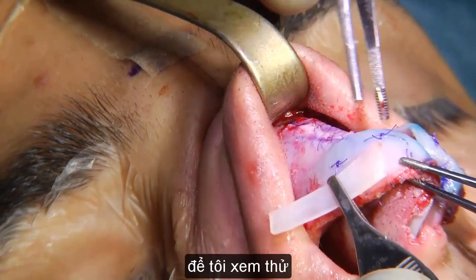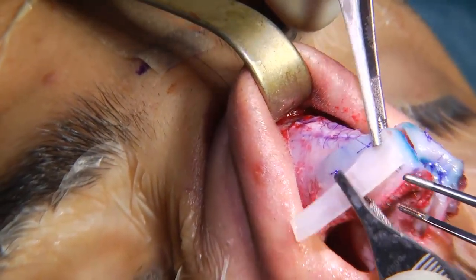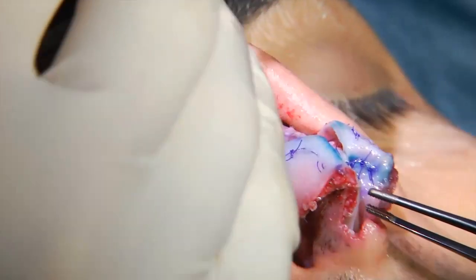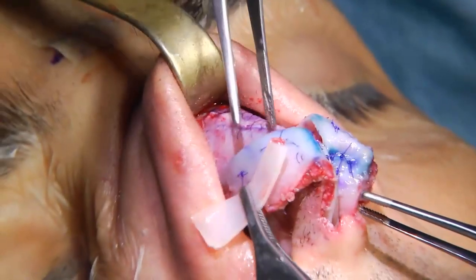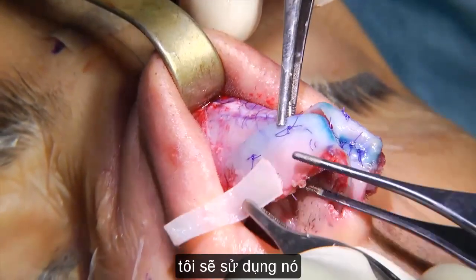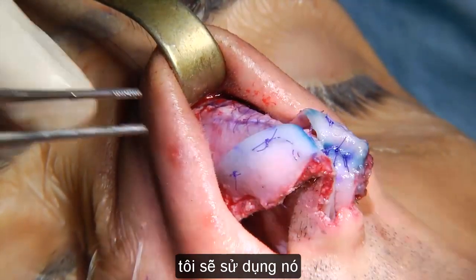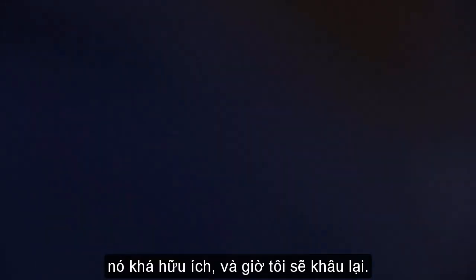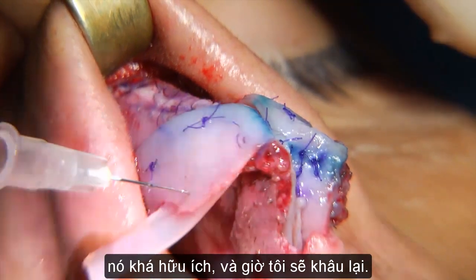Too big? Now let me just see. I will use it. So this will help me decently, and then I will use my spanning sutures.